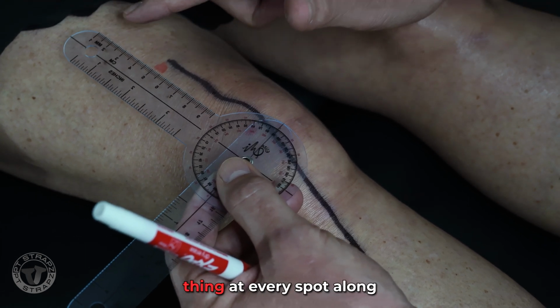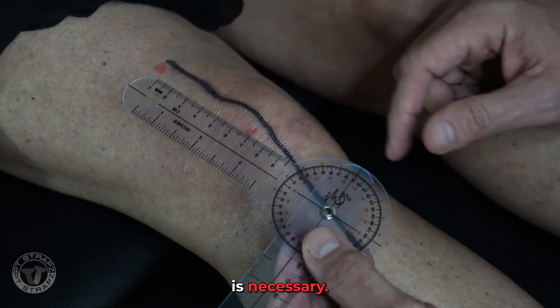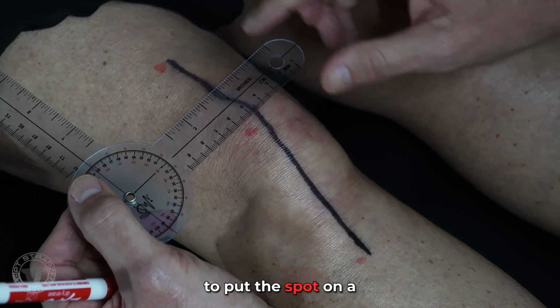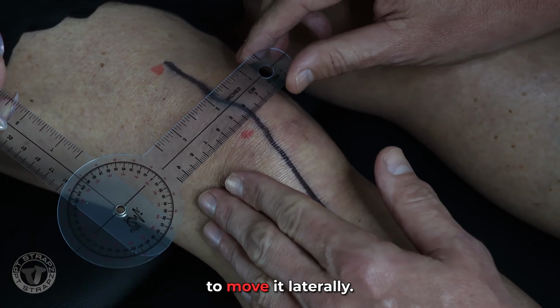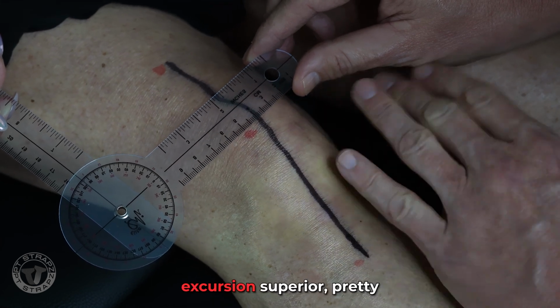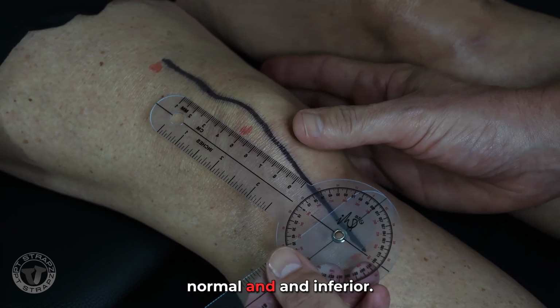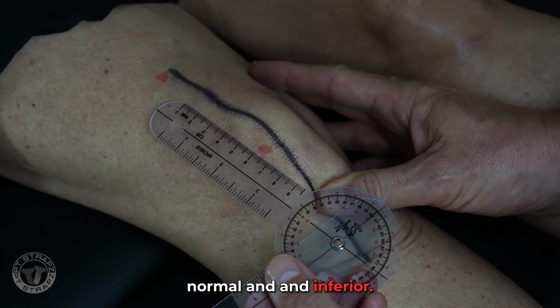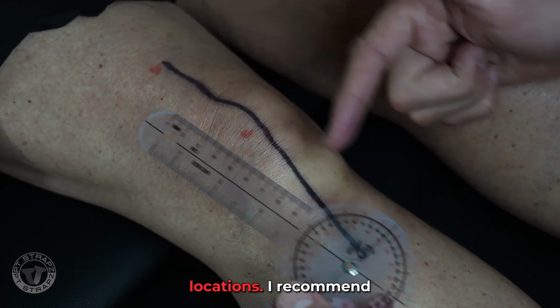And I'll do the same thing at every spot along the scar that I feel is necessary. Once again, I'm going to put the spot on a designated point on my goniometer, and I'm going to move it laterally, medially, measuring the excursion, superior, pretty normal, and inferior. So that gives us those values at each of these locations.